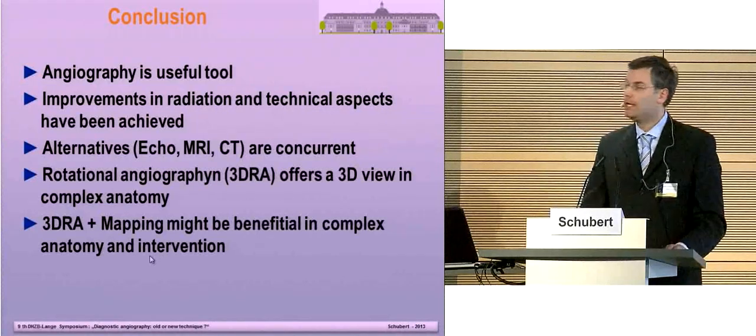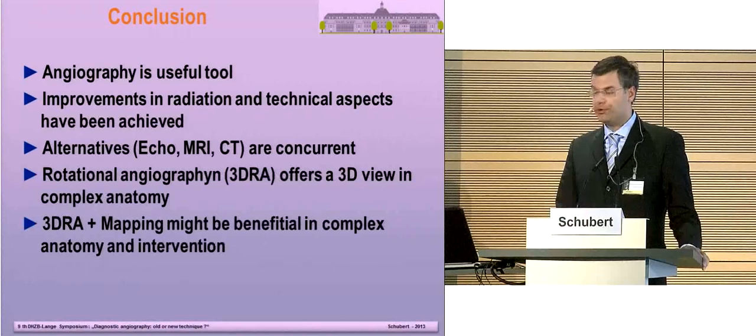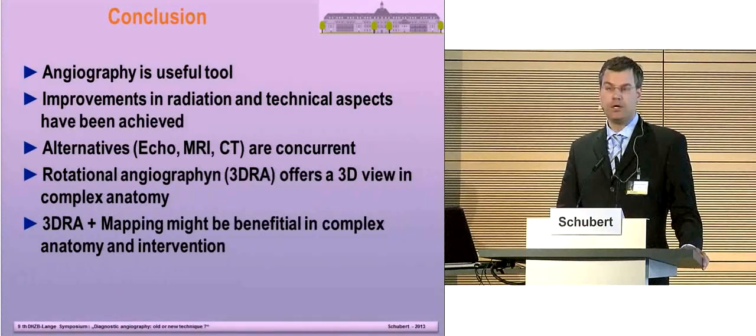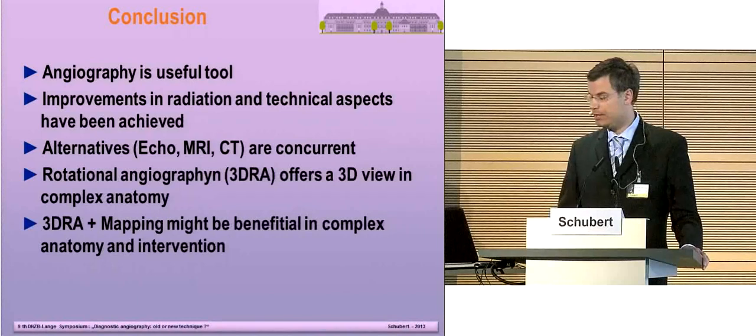So in conclusion, angiography is a useful tool. Still, old or new, it is necessary for most peri-interventional procedures. It is also sometimes necessary in the diagnostic process of patients undergoing surgery or post-surgery. We have good alternatives with echo, with 3D echo. We have good alternatives with MRI and maybe also CT.